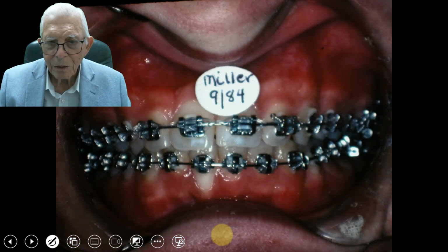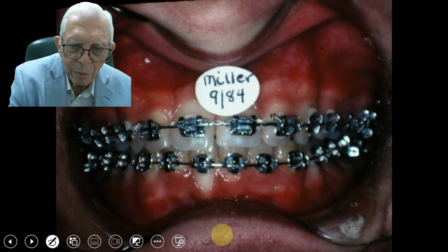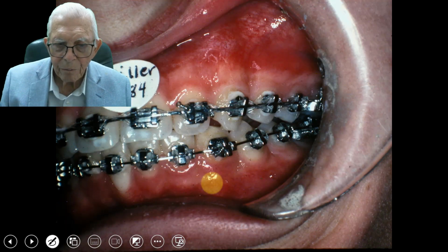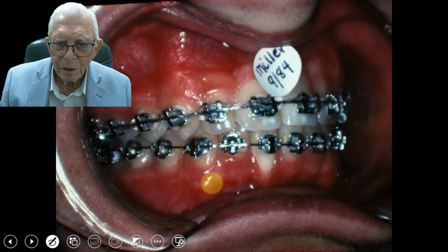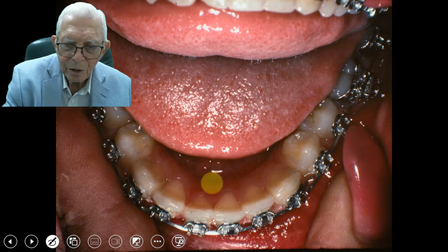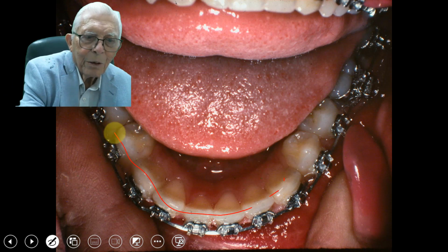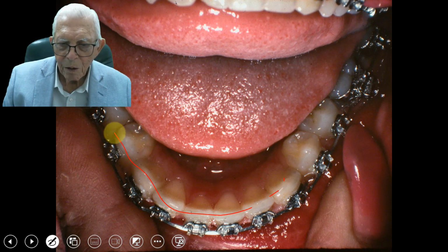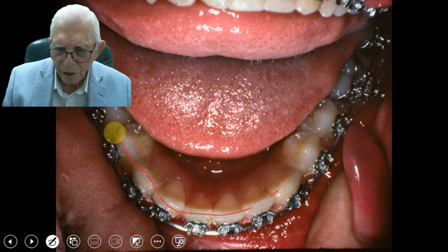Now this is 1984, and we're bringing that tooth into place, and we have to torque it in to get the root back in this side. Now let's get where we look down on that again. So we've got this tooth lined up in here, and we didn't take anything out of this. We've opened that, and that's fitting together.